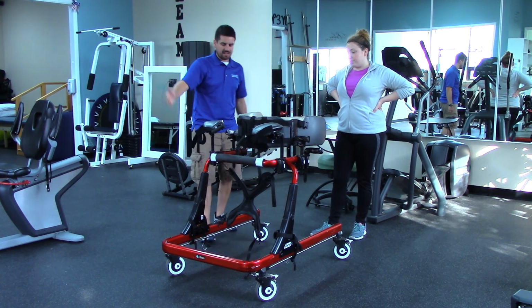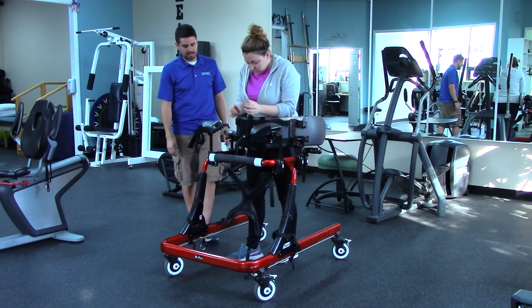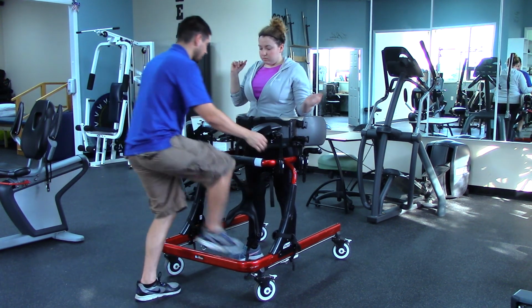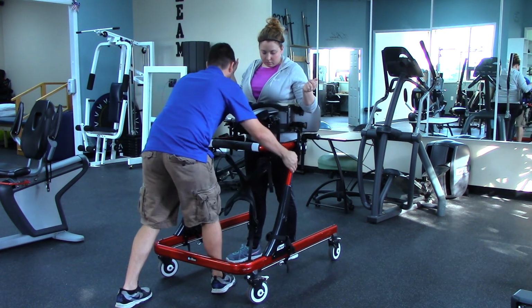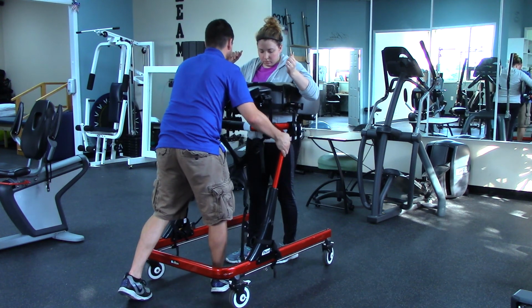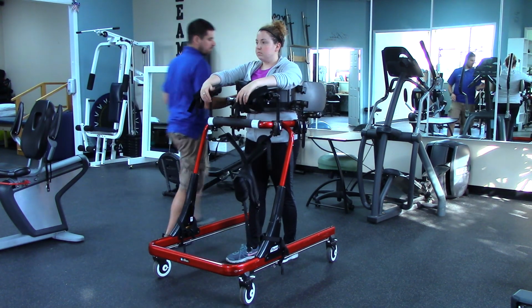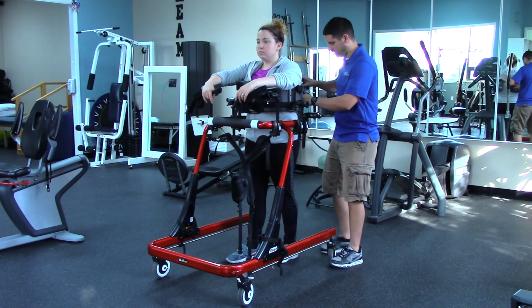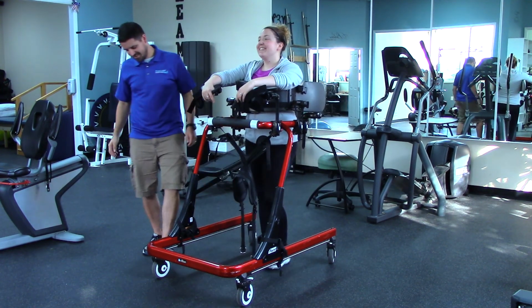So you can step into it, and I'll get it set up on you, and then you can get it set up on me. We're obviously going to want this up a little bit. There are two levers on the side here. You're going to pull them in and then pop it up. So I'm going to get it way up. Okay. From here, we're strapping the back. It has four brakes, which we should definitely be using right now.